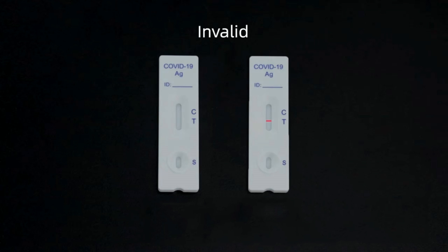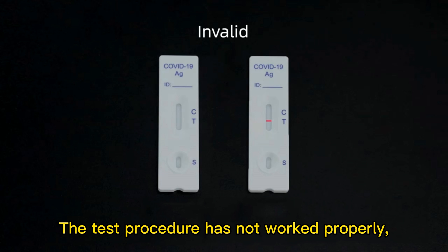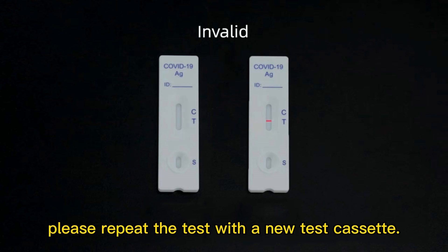Invalid: If there is one line only at the T line, the test procedure has not worked properly. Please repeat the test with a new test cassette.